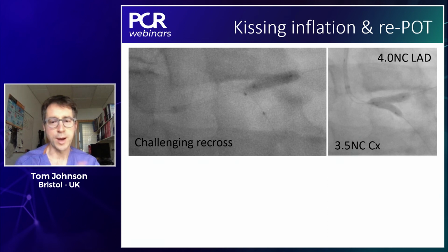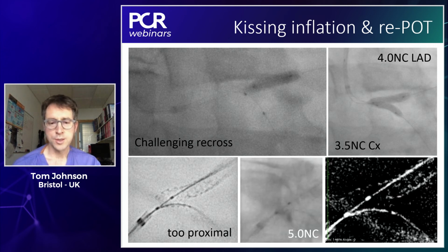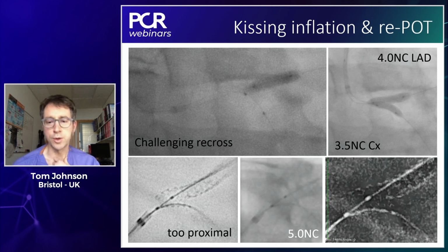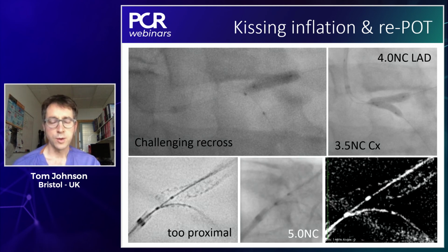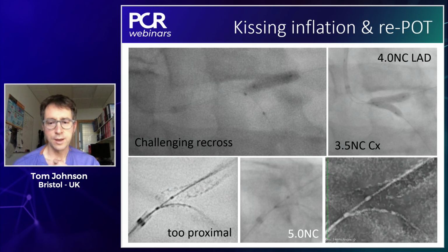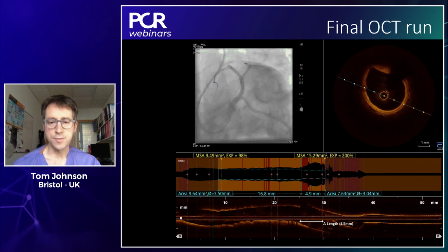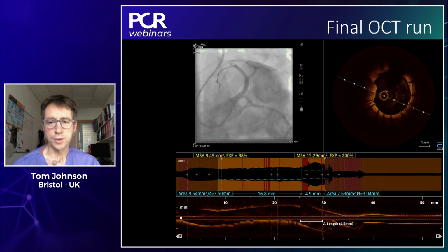We heard earlier about the potential of hematoma and swelling. And then importantly, to go back and position a POT, trying to avoid the carina that we have just fashioned. And so this is a 6 millimeter length, 5.0 diameter balloon. And again, just showing, if you don't have the imaging available, then a StentBoost can offer you very clear evidence of where you're placing your devices. But it allowed us to facilitate a very nice final result.